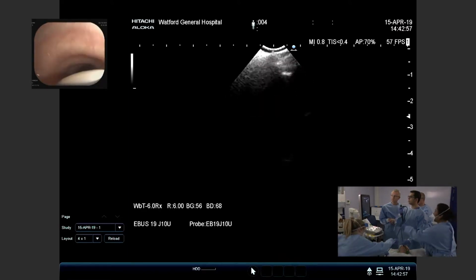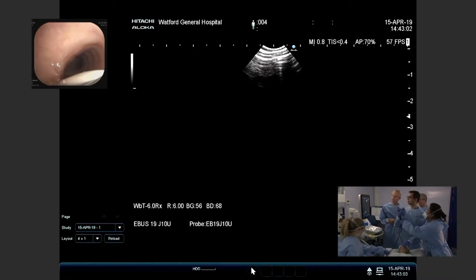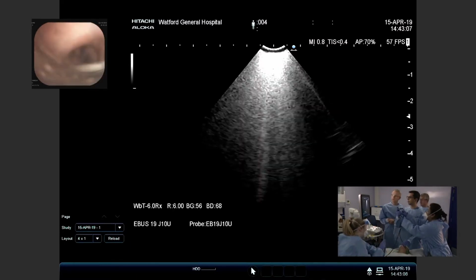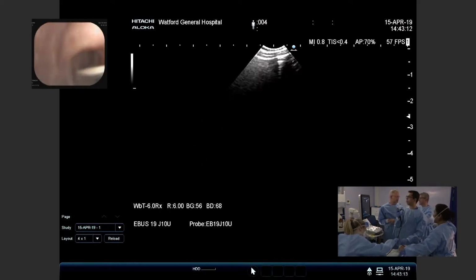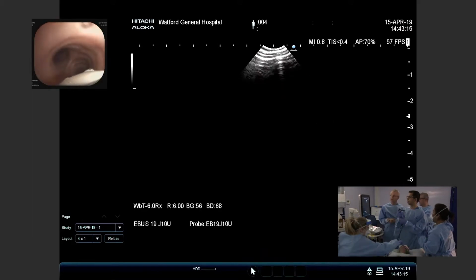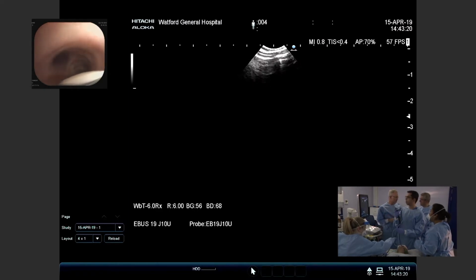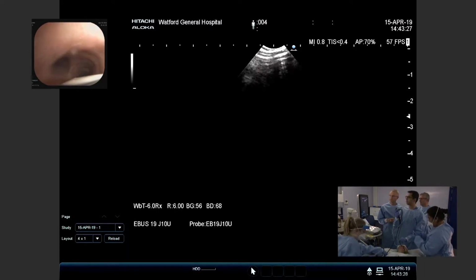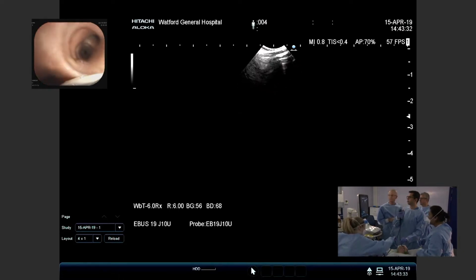All right, yeah. Just going to put some local anesthetic. Go for it. So the difference here in technique is this lady's had direct application of local anesthetic onto her larynx as opposed to the cricothyroid approach. Just putting a little bit more local anesthetic. It is very different. Did you notice that she coughed a lot as the scope went through the cords? Absolutely, and that's why we moved to doing it the way we do. So the quality of the anesthesia is very different, I think.